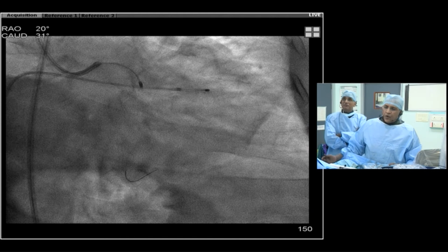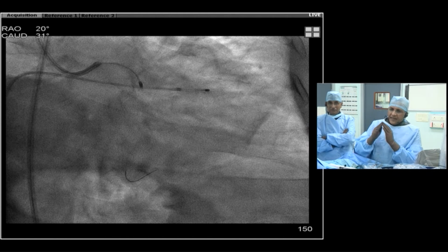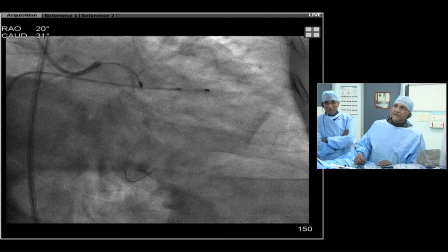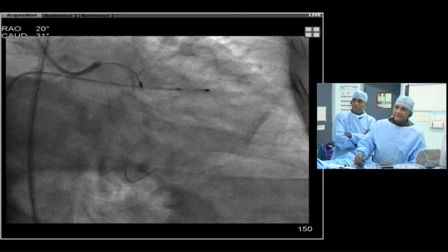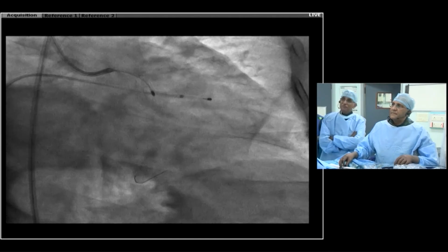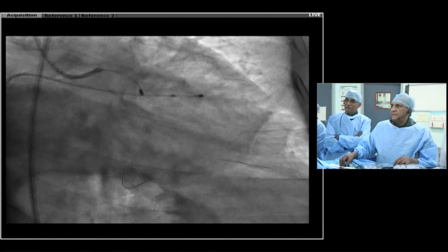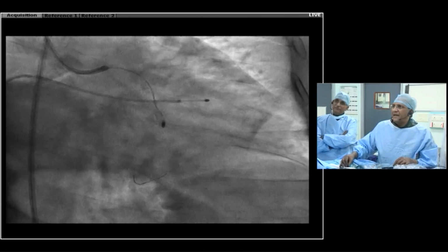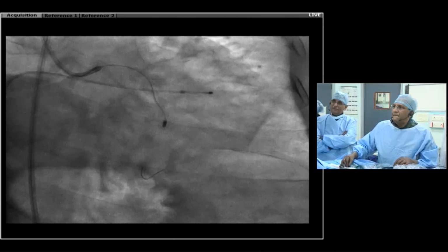It's only when we do long ablations in tortuosities that this whole thing opens up. I'll show you some high resolution photographs tomorrow if I can. I personally would be a little reluctant to use a 1.25 in this case because it's a tubular lesion. I think you're primed for burr entrapment in a case like this.